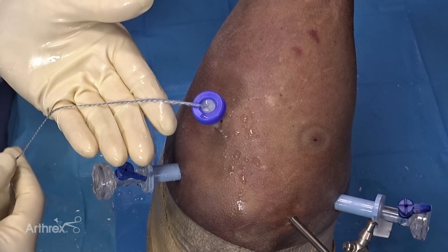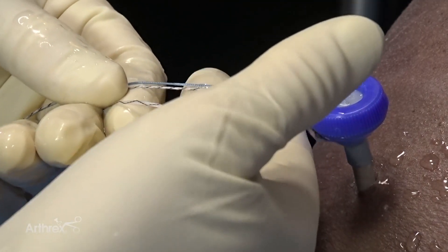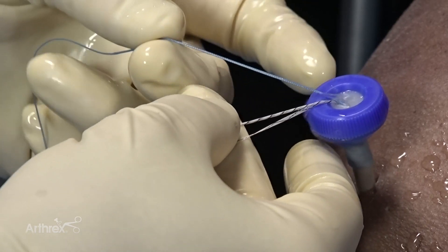After our anchor is set securely, we'll separate our sutures. You can appreciate the repair stitch, which is dark blue, and the shuttle link, which is tiger. We'll set aside the repair stitch and focus primarily on the shuttle link.